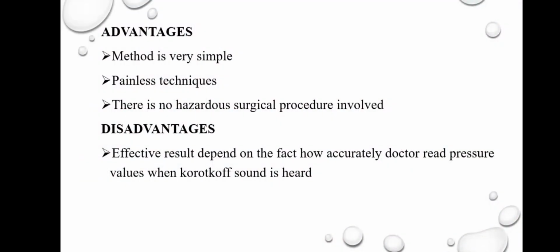The advantages are that this method is a very simple, painless technique, and there is no hazardous surgical procedure involved. The disadvantages are that it is not accurate and error may occur as it involves manual reading.